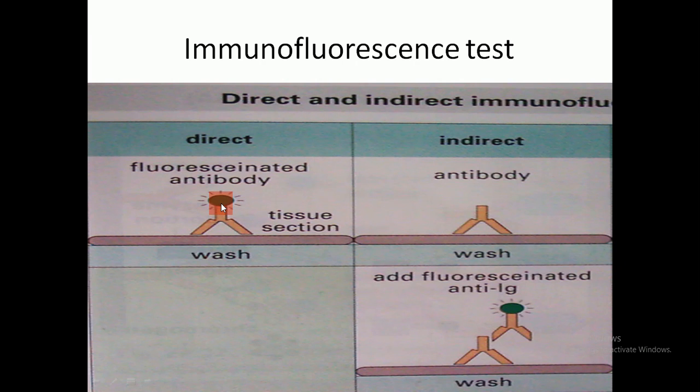And this is used to detect autoimmune disease in glomerulonephritis or in pemphigus vulgaris, which is an autoimmune disease of the skin, characterized by blisters filled with fluid.